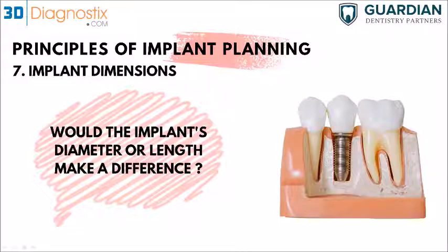So if the question is to remove the sleeve from the guide, it's not going to be possible because we glued the sleeves inside the guide. So you'd have to take the whole guide out and use the osteotomes. And if you want to place in the implant, place the guide back in, just to guide you to place the implant through the sleeve, you can do that. So you can actually remove the whole guide and then use the osteotomes and then place it back in if you want to place the implant through it. Or just continue freehand.